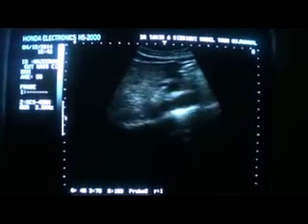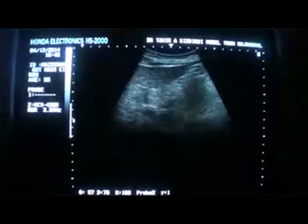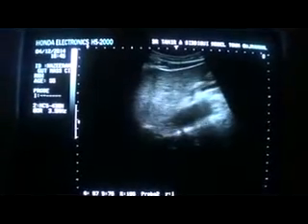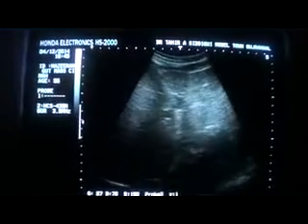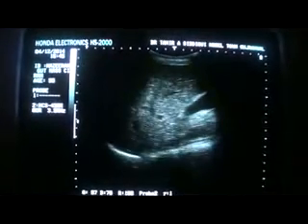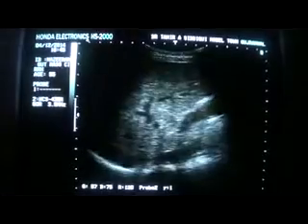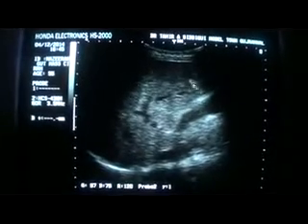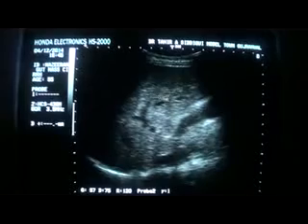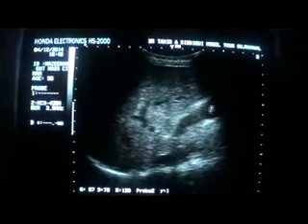This is an ultrasound study of a 55 years old female, and she is suffering from cirrhosis of the liver, and chronic liver parenchymal changes are quite evident. This is the gallbladder. Walls appear thick due to diffuse parenchymal changes of the liver. As itself, the gallbladder is normal.